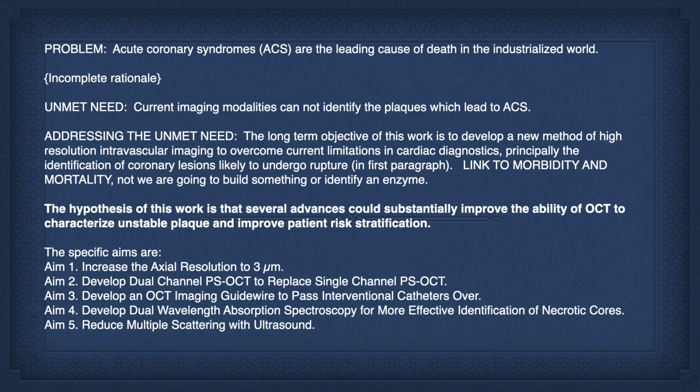So, addressing the unmet need. The long-term objective of this work is to develop a new method of high-resolution imaging to overcome current limitations in cardiac diagnostics, principally the identification of coronary lesions that will undergo rupture, or that could even be better if it said ACS.